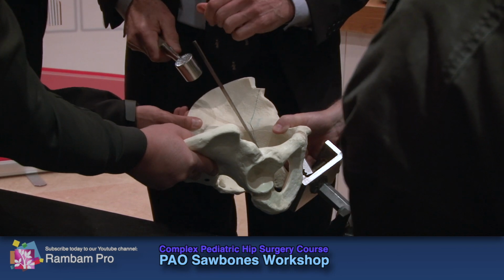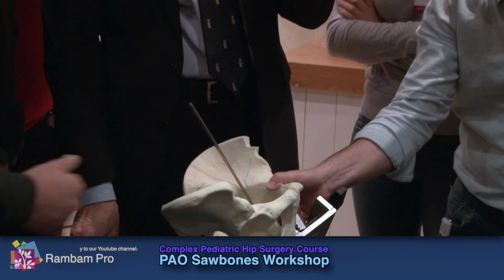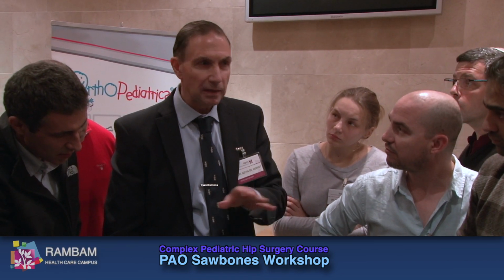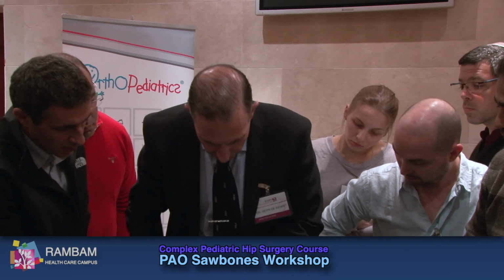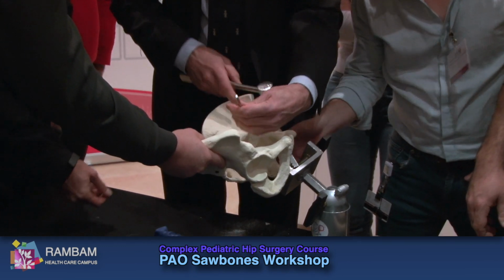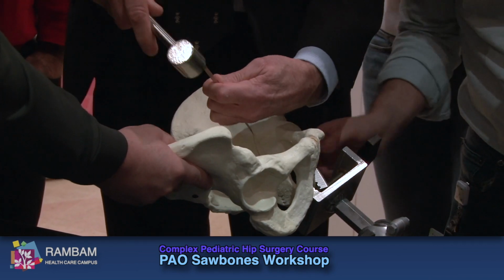I'm not concerned about where this has gone entirely, because I only cut the medial cortex, so I haven't gone all the way through. And I check that I make sure that's all right. Then I know that if I then go perpendicular to this bone, perpendicular like that, come out.